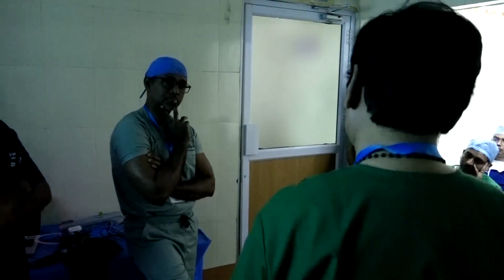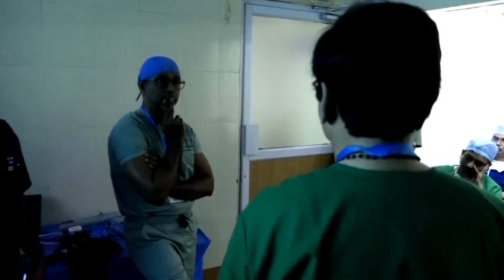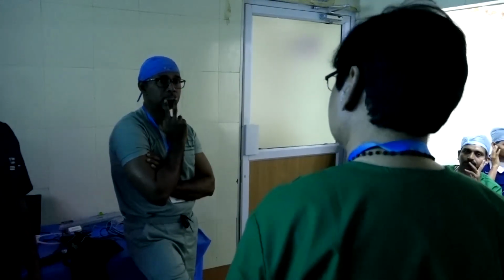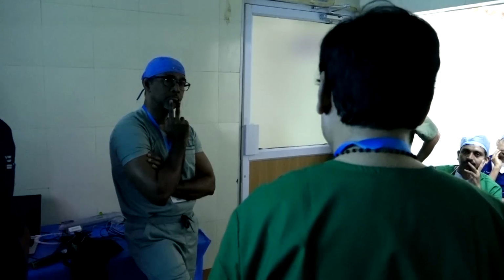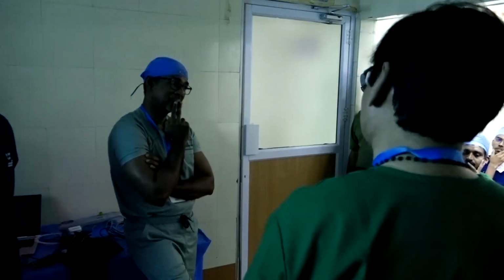There are plenty of real-world difficulties with IVLs, with rota and everything. We have got bulk experience with these devices. Calcium itself, that's why I'm telling, means you have to do more and more effort. You have to sweat more. Calcium means, in CT1 calcium.